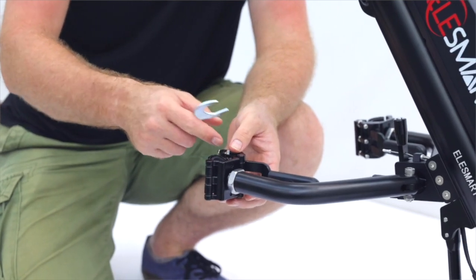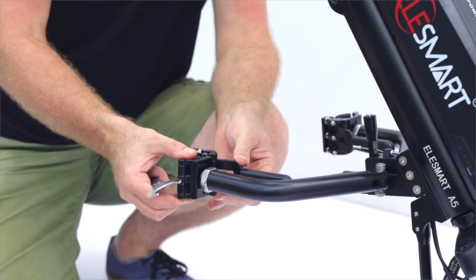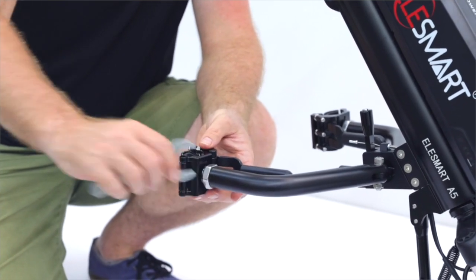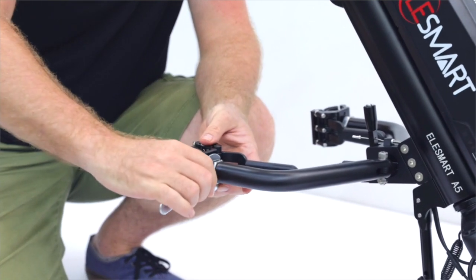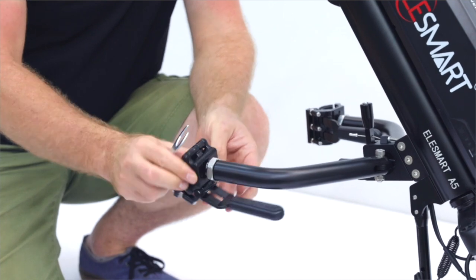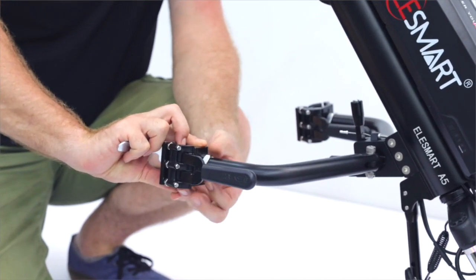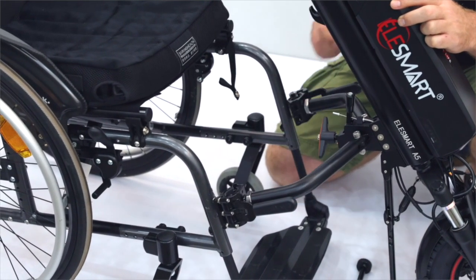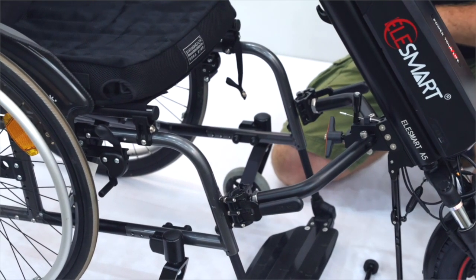Next, during shipping, the clamp levers are turned inward. We want to turn them outward so we can install it on our wheelchair. By doing that, we can use the wrench included in the packaging, just loosen the bolts a little bit, turn them outward, and tighten them with our hand first, to adjust the angle of the clamps and the attachment arms so that they fit our wheelchair.